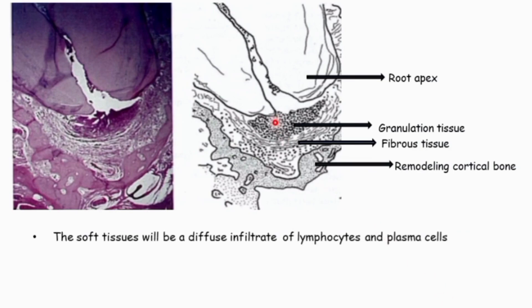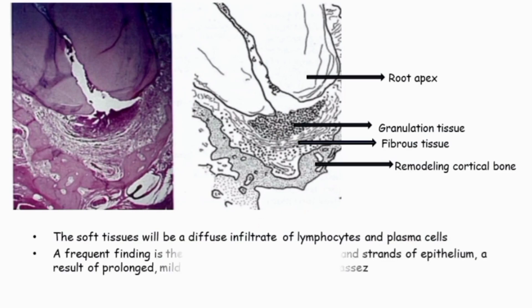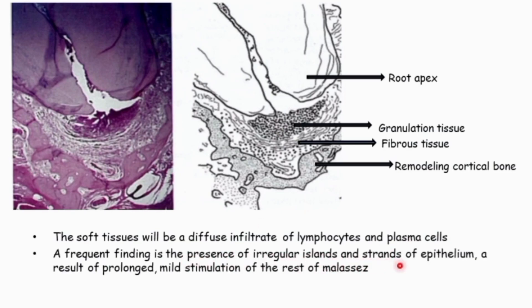Inside the central zone of granulation tissue, we can find infiltration of lymphocytes and plasma cells. In addition to it, we can also see irregular islands and strands of epithelium inside the central zone of granulation tissue, and this is because of prolonged and mild stimulation of the rests of Malassez.